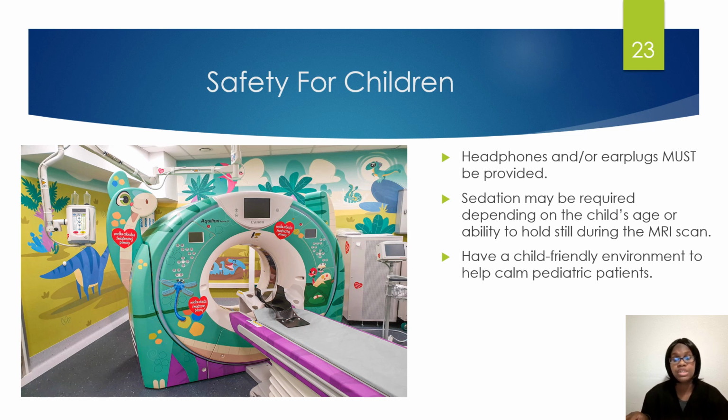So, for safety for children, you want to make sure that you provide headphones and or earplugs or even earmuffs that protect the child's or the baby's ears, especially if they are a newborn. Depending on the age and how well the patient can hold still and tolerate being on the table for a long time, the patient may or may not need to be sedated. And it's also good to have maybe a family member in the room, and a child-friendly environment to help keep patients calm.